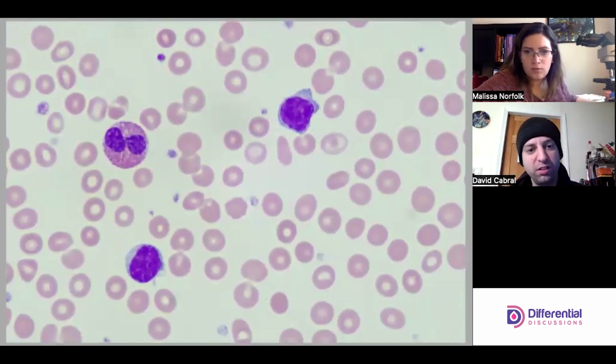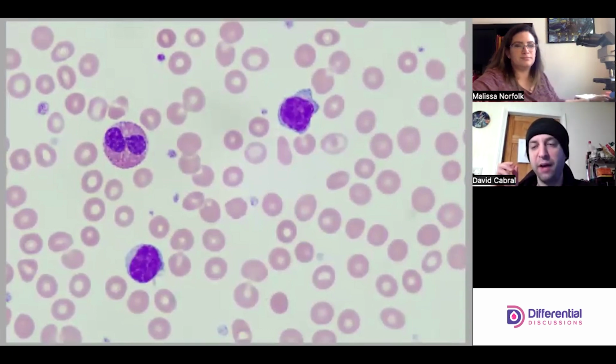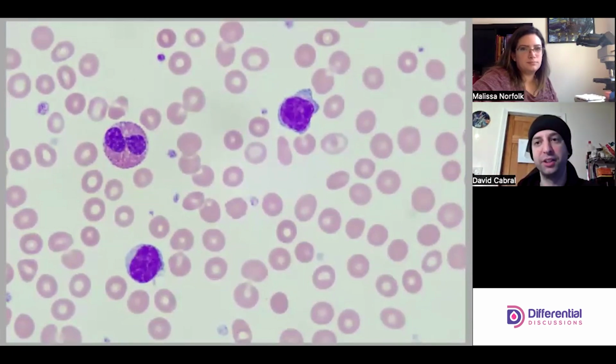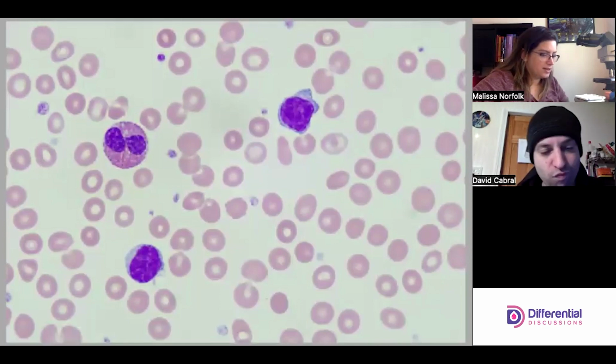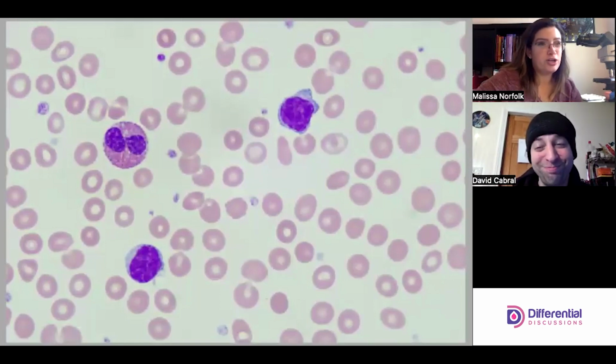Oh, well, so there are some projections coming out of that lymph now, right? So I think at this point I'd be very compelled to give this to pathologists, and maybe before I'm even done with the diff, I note this in my mind. This is now looking weird. Yeah, absolutely. And in that clinical setting, you can say to the pathologist, "Here you go, your job to figure this out, whether these are hairy cells or not."